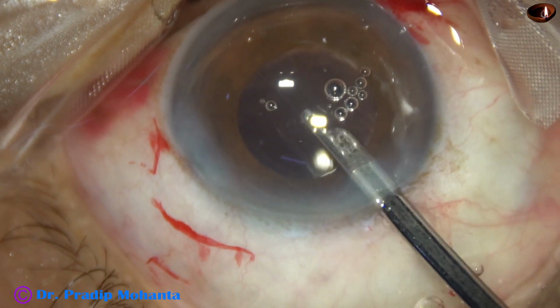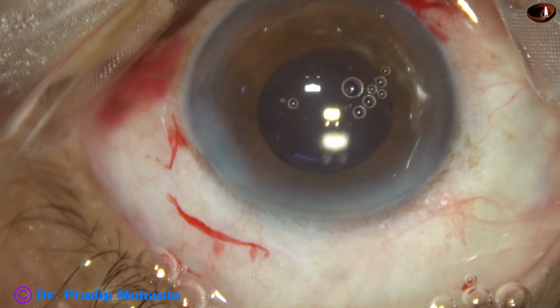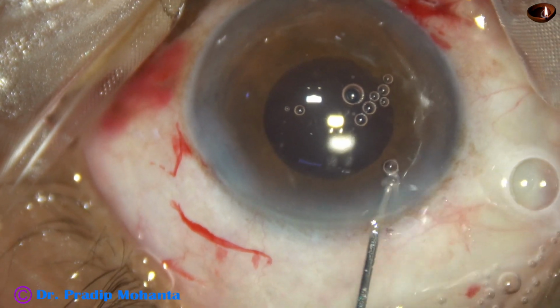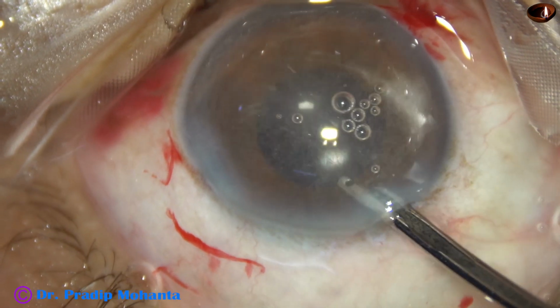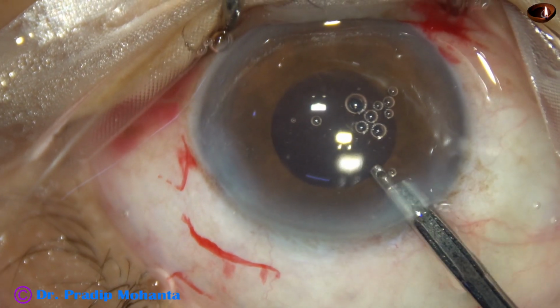The pupil looks round, but on more final check whether any vitreous strand is there or not. Inject a little bit of triamcinolone, not much, just a little bit, and check if there is any vitreous strand.